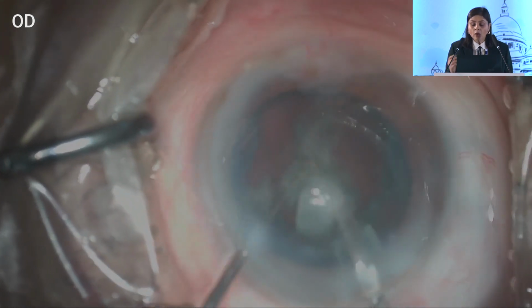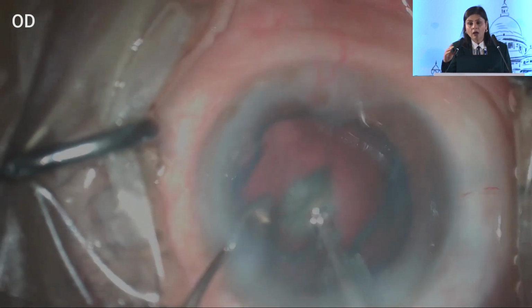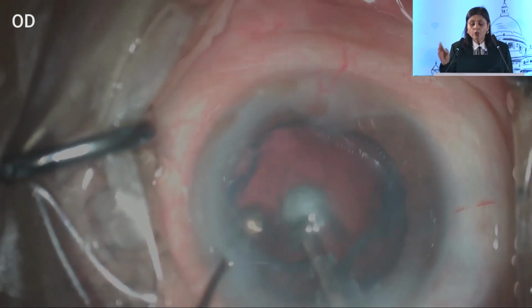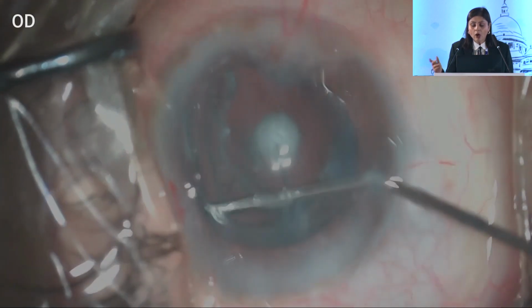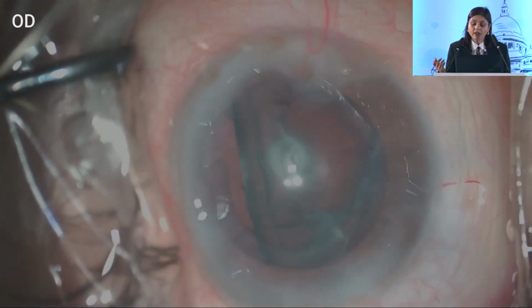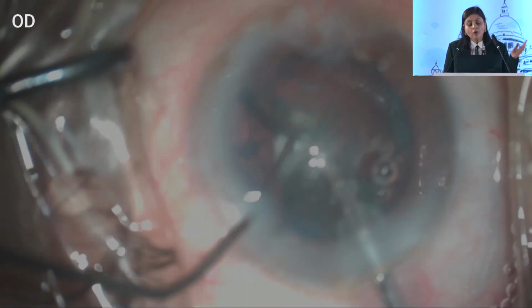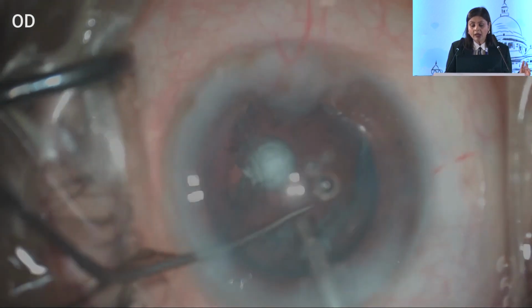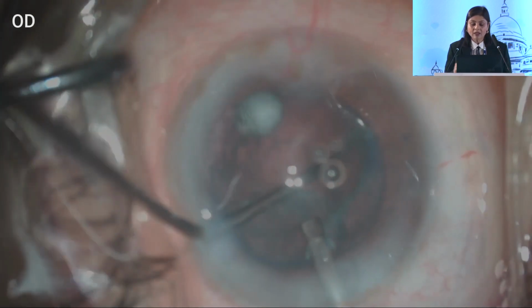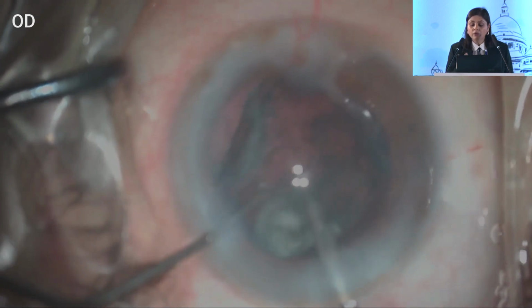Another important aspect to remember here is, like I said, we do limited viscodissection, never ever do hydrodissection in patients with posterior polar cataract. Before I come out and stop the infusion, always maintain the chamber stability, and I've injected dispersive viscoelastic. Now before removal of the epinucleus, again something that I typically like to do in posterior polar cataracts is inject again a little bit of dispersive OVD under the epinucleus before removing it.